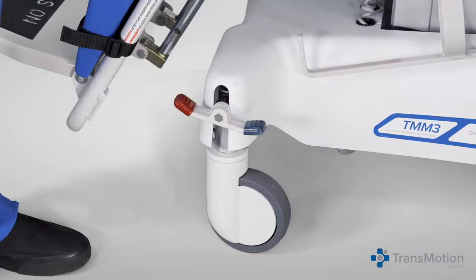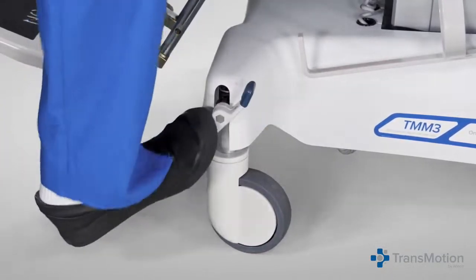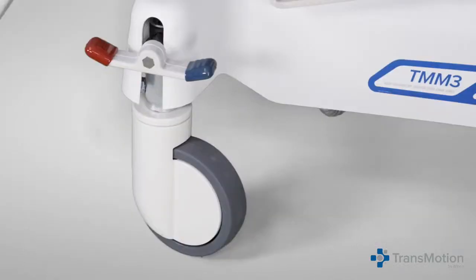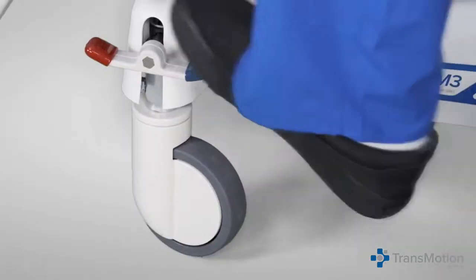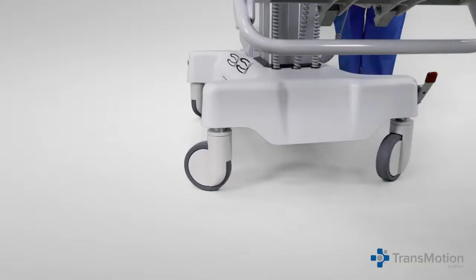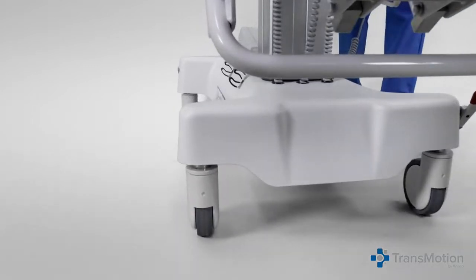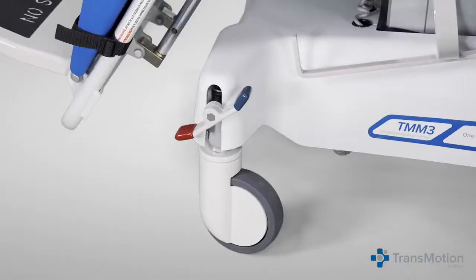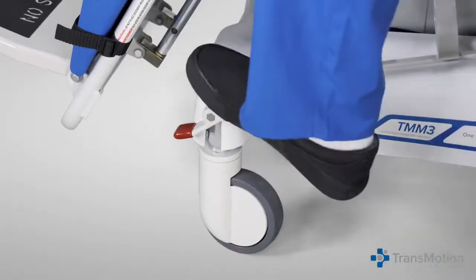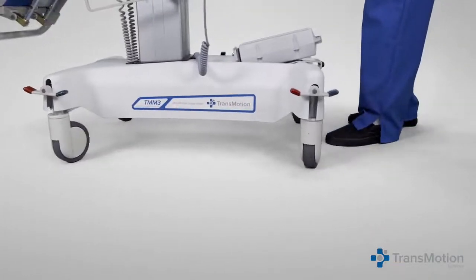The braking system is activated by pressing the red end down. In this position, all casters are locked. The steer lock system is activated by pressing the green end down. When activated, the caster on the patient's right foot will lock parallel to the base and the caster will still roll. The other three casters will swivel and roll freely. In the neutral mode, the brake pedals are in a horizontal position and all casters are able to swivel and roll freely.